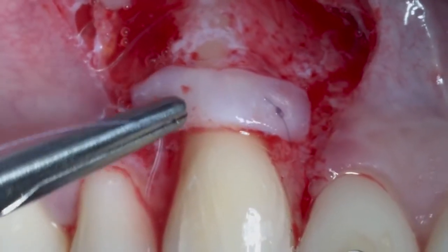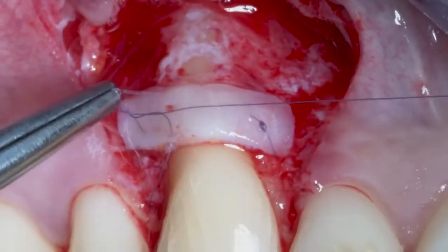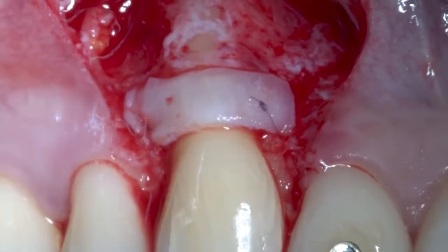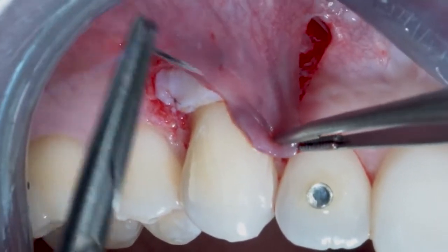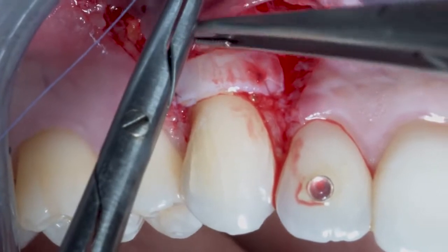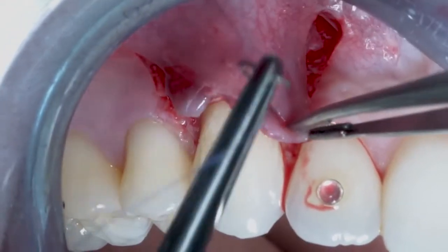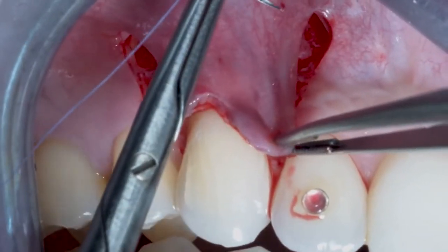You need a real connective tissue — not fat, not glands — but really white connective tissue to put underneath your flap. You can see the white color of the connective tissue in the video. The connective tissue also has to be very thin so as not to damage the aesthetics of the patient: very thin, white, and well-shaped to the dimensions you need.